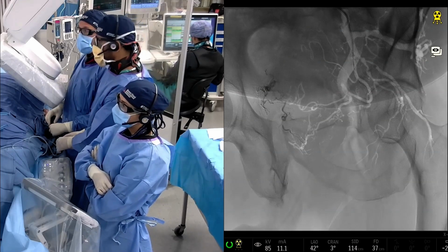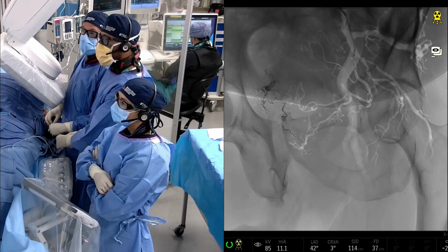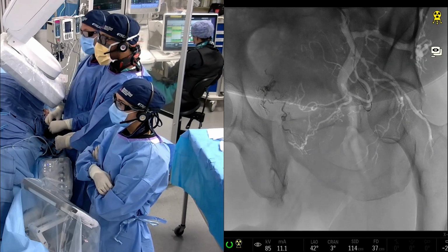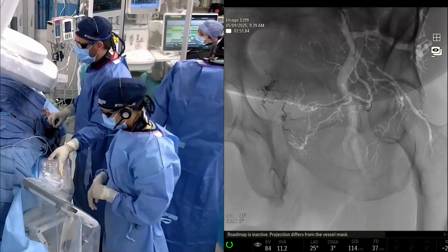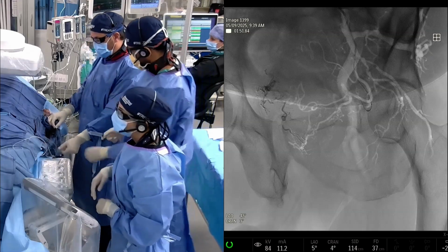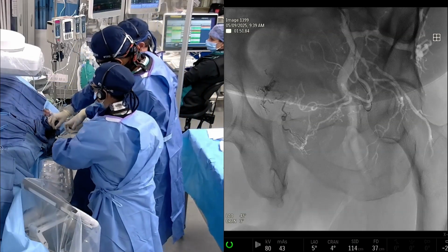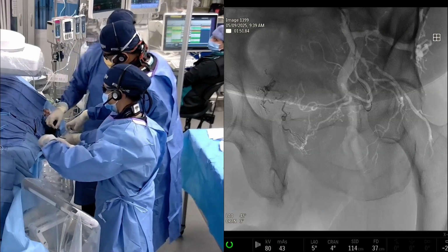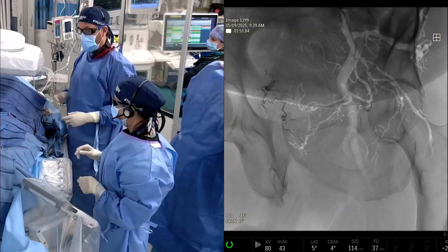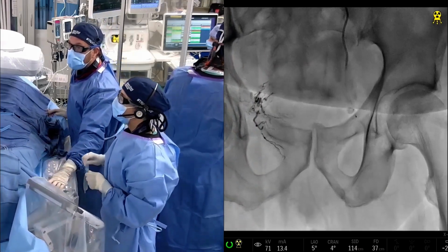All right, so Sid was able to get the wire past that bladder artery, and now we very easily can just sail it over there. So you guys wanted to just do another run here. So I think probably what I'm going to do is stop here, and we're going to go to AP. I think that'll give us a little bit more information. And so I'm trying to minimize contrast on this patient. We've only used about 15 cc's so far, which is fine. But again, cone beam CT is another thing that uses contrast, depending on how you utilize it. And so we're probably not going to do that in this case unless we absolutely need it.